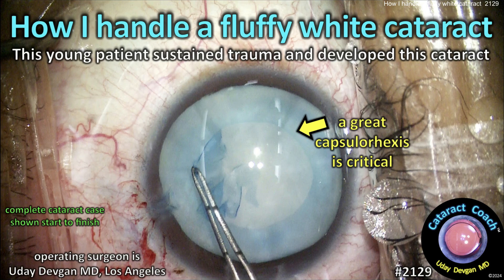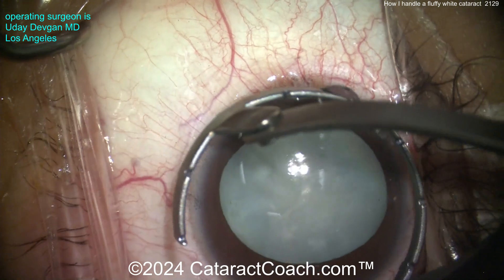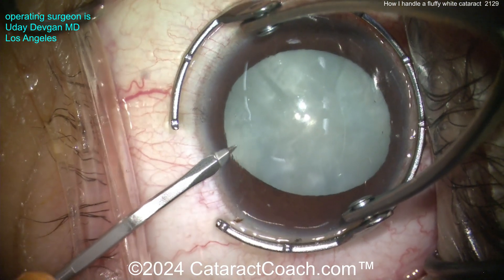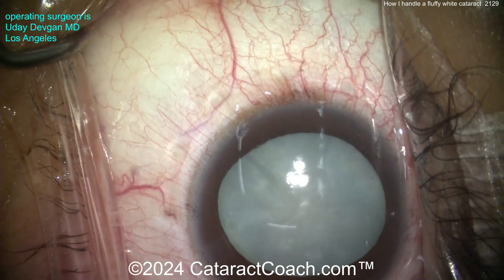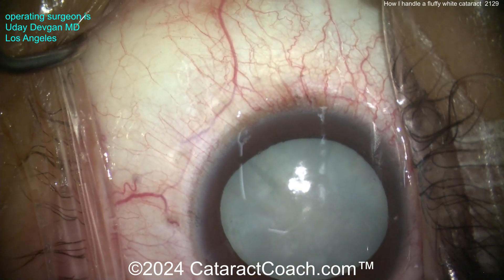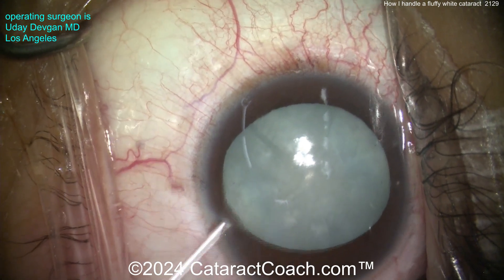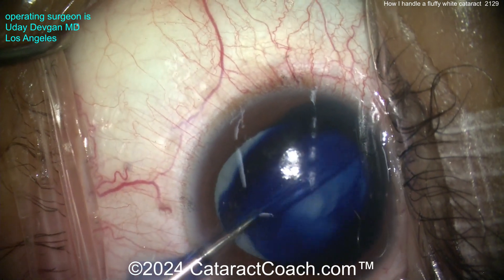CataractCoach.com — how I handle a fluffy white cataract. This young patient sustained trauma and developed this cataract. In yesterday's video (2128), there was a young patient also with a soft white fluffy cataract, and the guest surgeon inadvertently put a phaco probe in the eye, put too much energy in, and popped out of the posterior capsule. We don't want that kind of complication here.